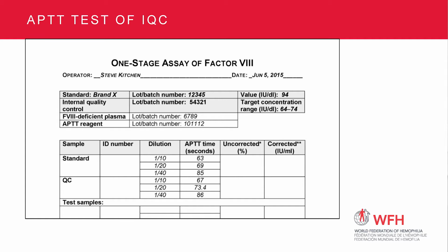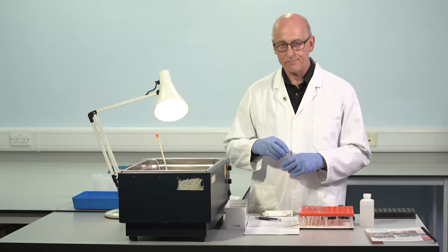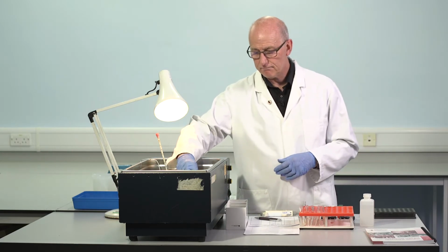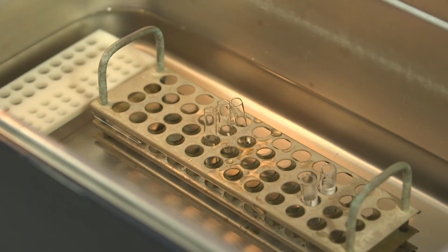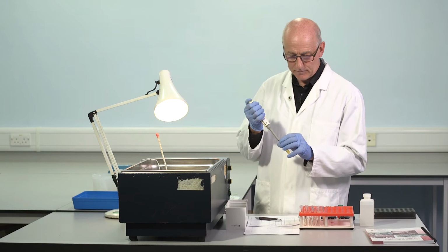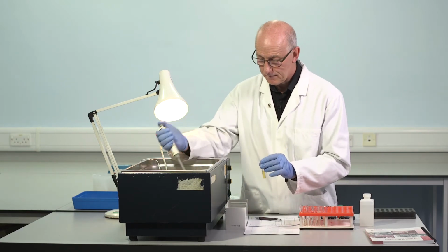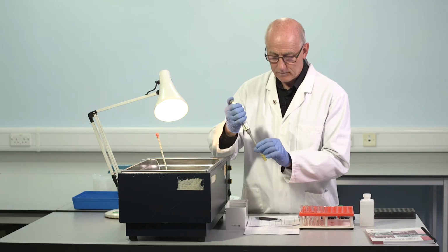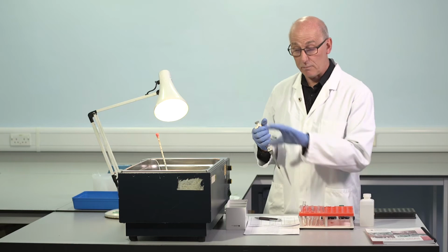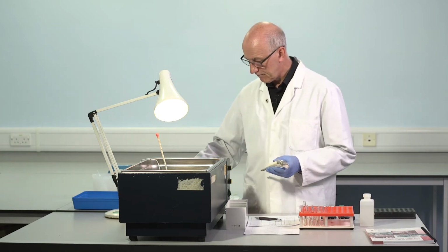So we've done the standard, we've done the internal quality control. We need to now test the patient samples. So for each patient sample, 3 glass tubes into the water bath, the same pool of factor VIII deficient plasma, 100 microliters each tube. This is simply coming up to temperature. Fresh tip.